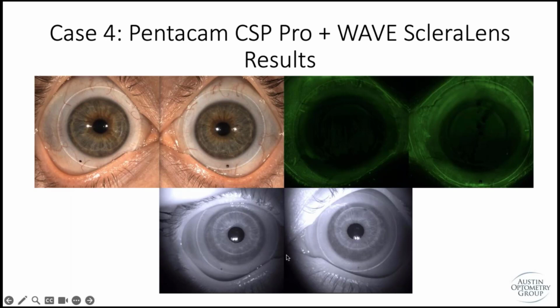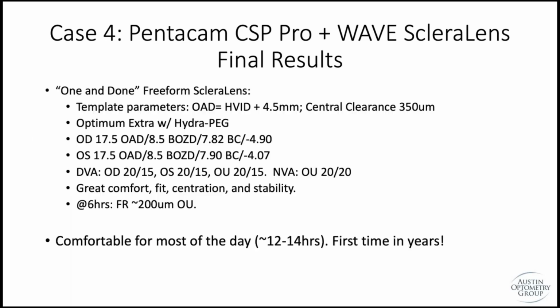Fit looks great. I always like to evaluate all my lenses in infrared. If you have a camera that has infrared, I feel like it gives me a lot of good information, whether it's corneal lenses, ortho-k, or sclerals, regarding the optic zones and movement of the lens. I can stare at the lens for longer without worrying about the patient squinting or being photophobic from the light. So I can really take my time assessing a lot of features of the lens, and there's not that much left for me to look at when I turn the light on. That's just a neat little trick if any of y'all are not doing that.